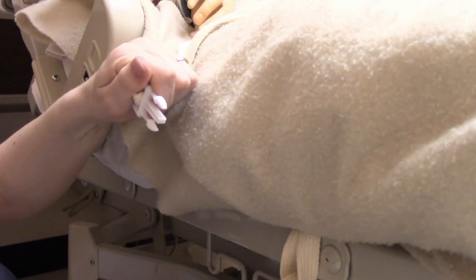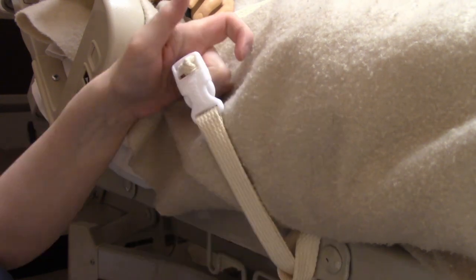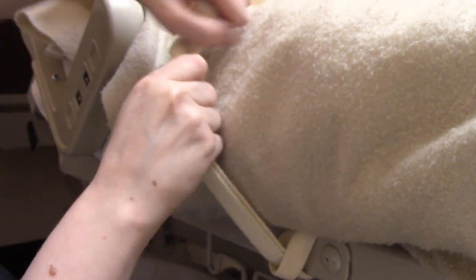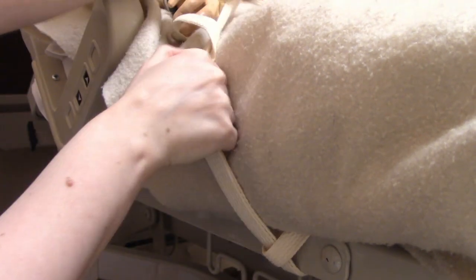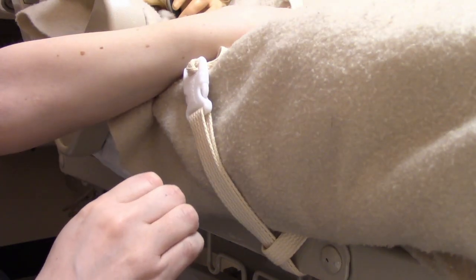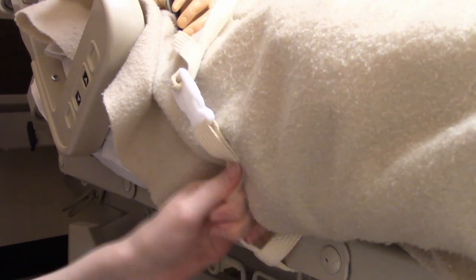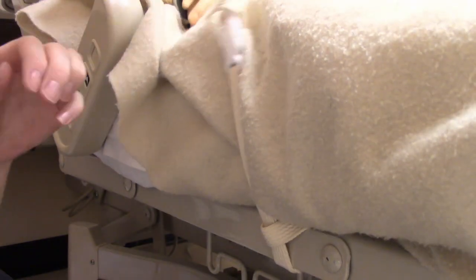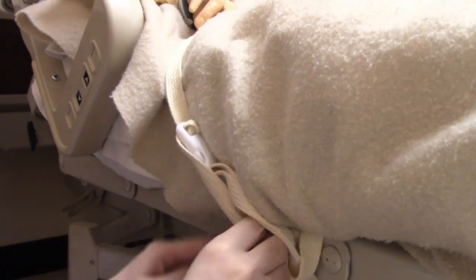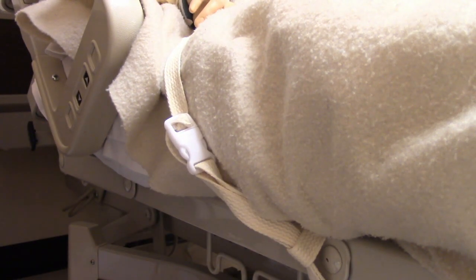Then you're going to take this piece and attach the two. Now it's attached but it's a little loose — not quite tight enough. So you need to adjust it so that it's appropriate for the patient. They need to have a little bit of wiggle room but you don't want it too loose where they can get out. Now it's in and it's secure. If you have a lot of extra strap hanging out, just tuck that under the bed frame and it's fine.